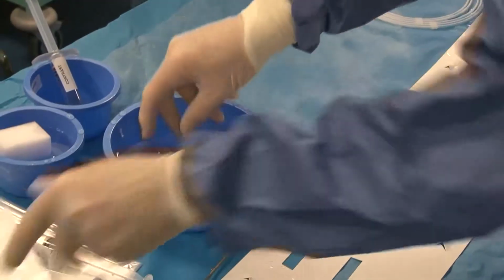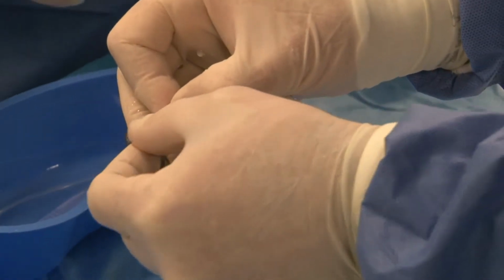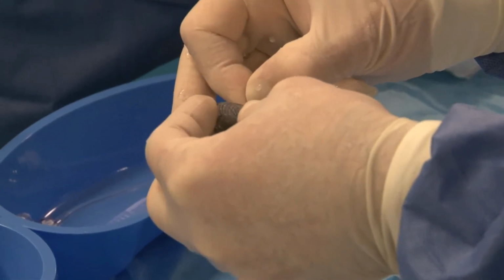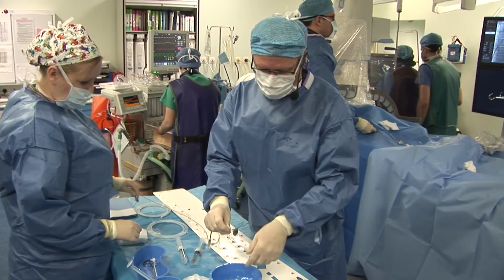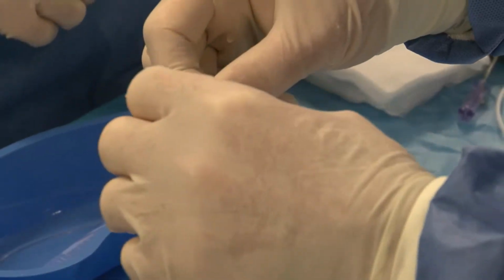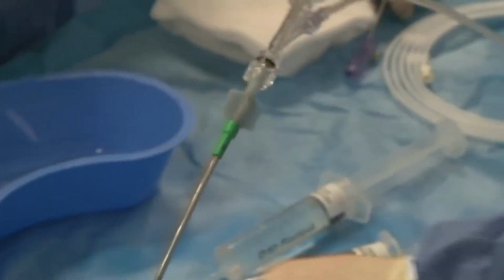Which we'll put straight into some heparinized saline and give it a good wash. The device screws onto the cable. It's hard to do it left-handed since I'm very right-handed. But we screw it on. I do it over the water just in case I drop it, because this is quite expensive. You can screw it on as tight as you like, and then you loosen it before you pull it back into the delivery sheath. So you just loosen it by a quarter or an eighth of a turn or so. You can feel it click as you do so, and then it's ready to go.